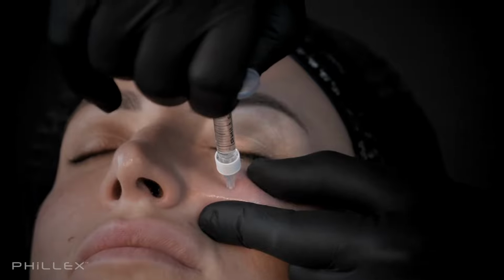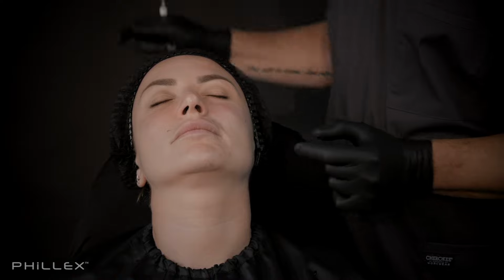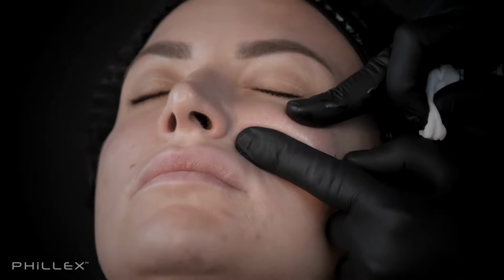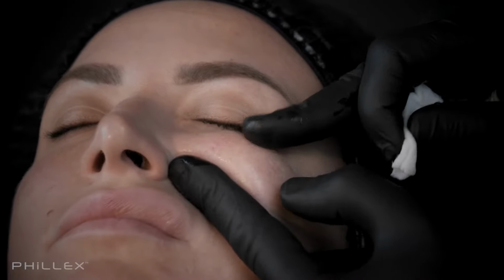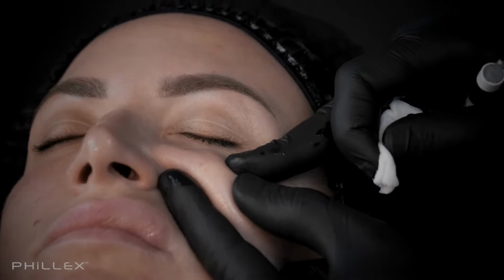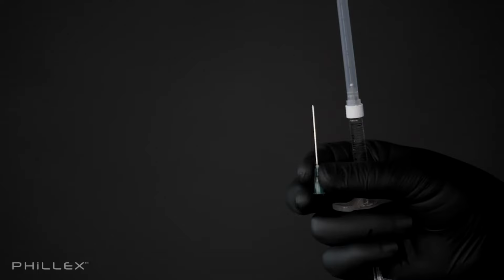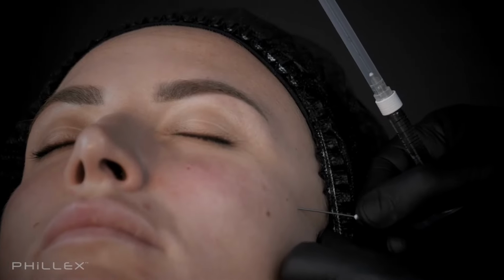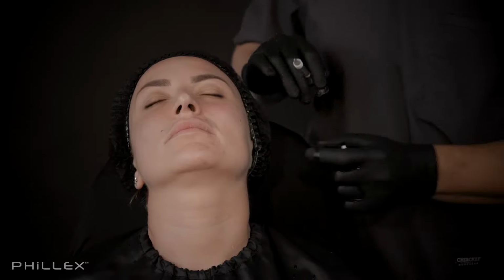The volume that I have placed is not too big for this area, 0.3 cc. Going out, and after that we are starting to make light massage with the help of surrounding tissues from down and from the sides. Next injection we can do with the bolus technique, or we can make it with the help of a cannula. In this situation, our goal is not to create a big volume, but just to make the contouring. And the contouring with the help of a cannula is more effective in this situation.